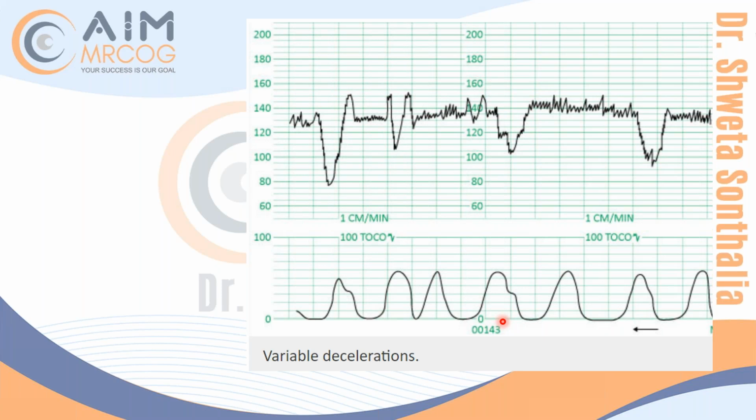We have to go for the history of the patient. No, we are not talking about the history of the patient here. We are not coming to the conclusion of the outcome. We are only reading the CTG, and I'm trying to categorize it. And I feel that it is coming with contractions. I am not noticing the detail that it is ending and starting before, not along with the contraction. But I'm under exam stress, and I'm thinking that it looks like it's coming with the contraction and ending with the contraction.